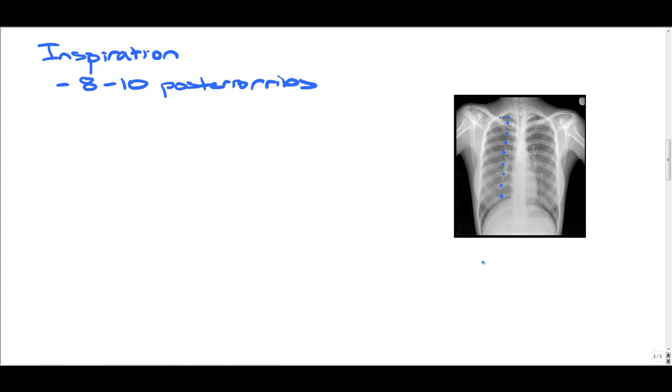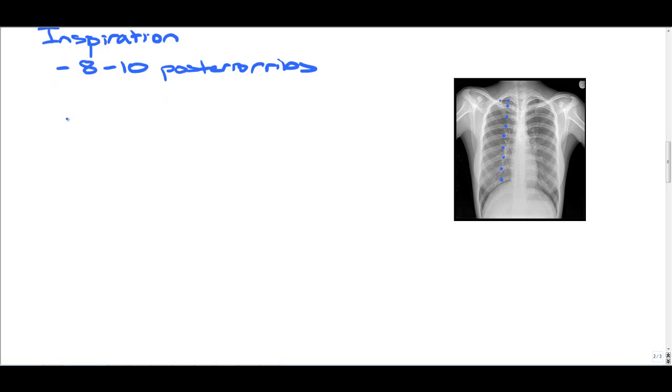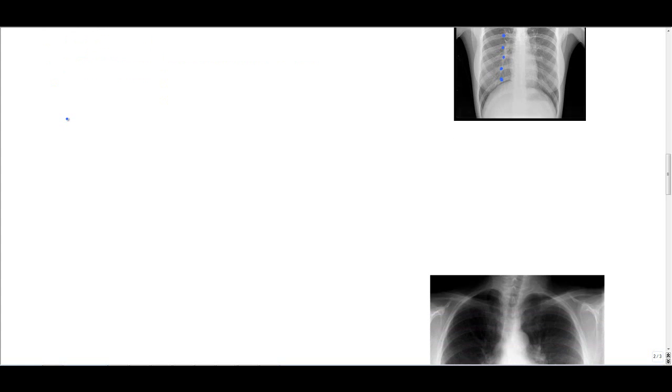In a non-hospitalized patient, you'll be able to see 10 ribs. Hospitalized patients, more like 8 to 9 ribs. The reason why this is important is that poor inspiration can lead to crowding the lung markings, and you may think you have a lower lobe pneumonia when actually you don't.